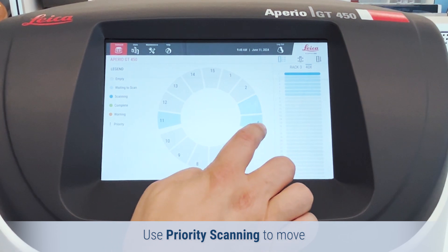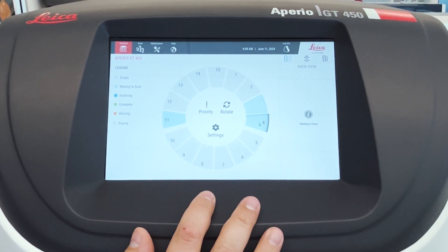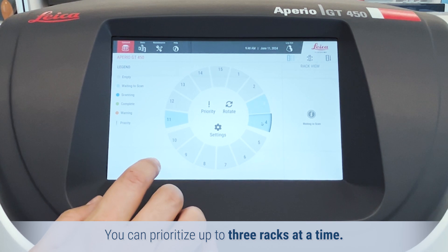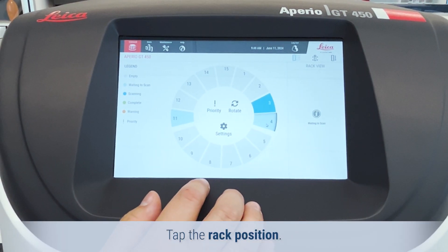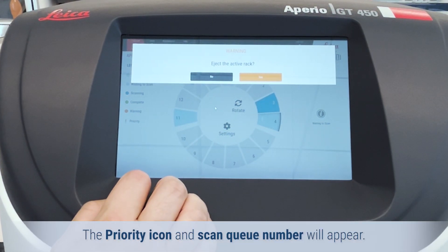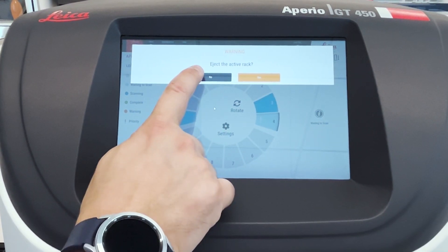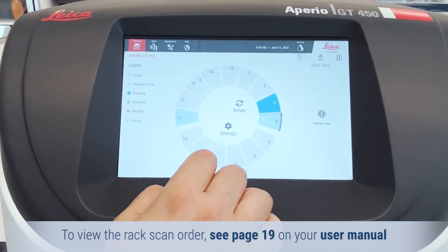Use priority scanning to move one or more racks to the front of the scan queue. You can prioritize up to three racks at a time. Tap the rack position, then tap Priority. The priority icon and scan queue number will appear. To view the rack scan order, see page 19 in your user manual.